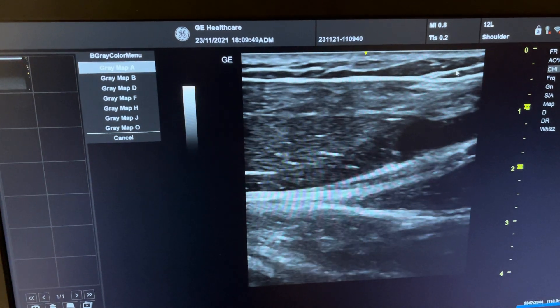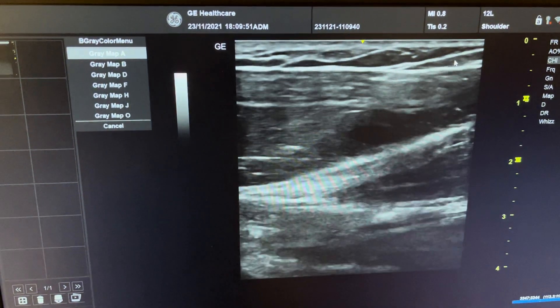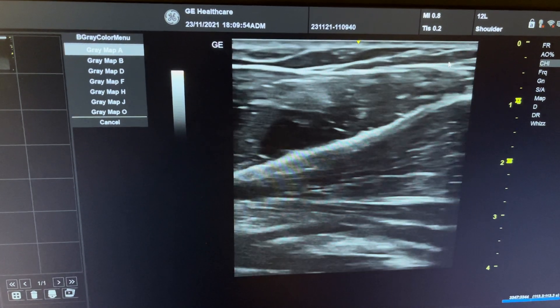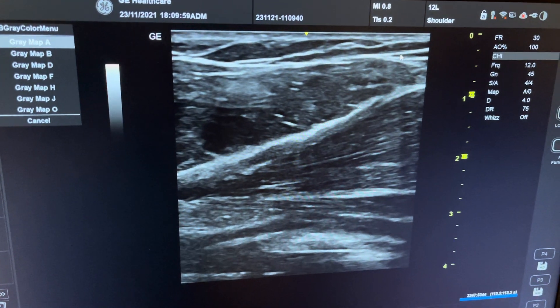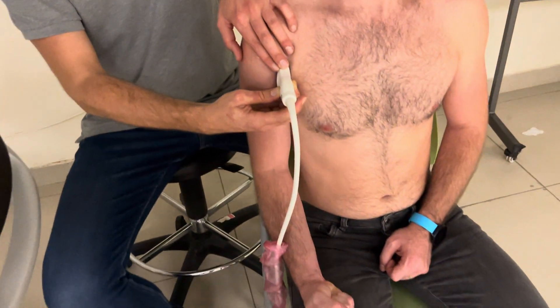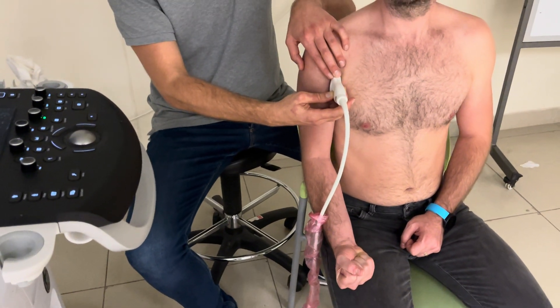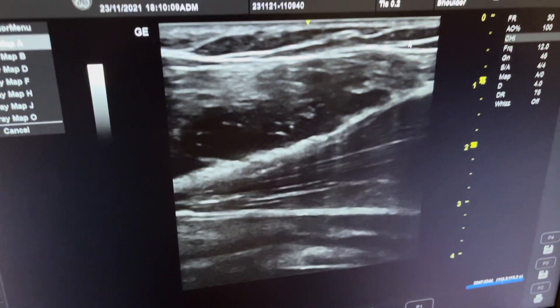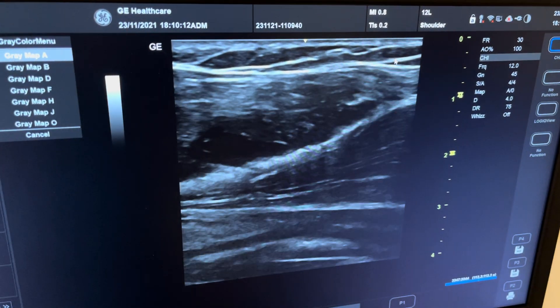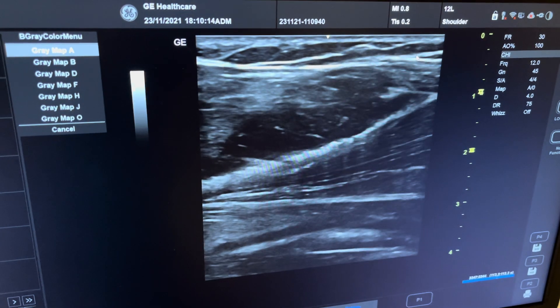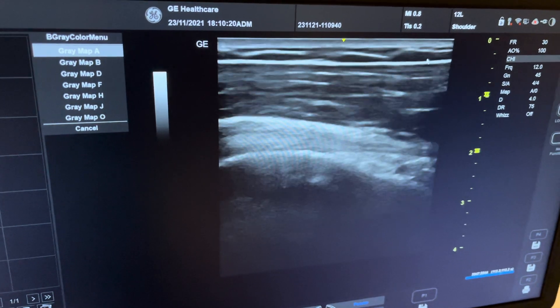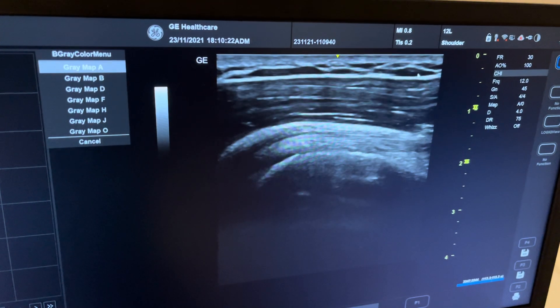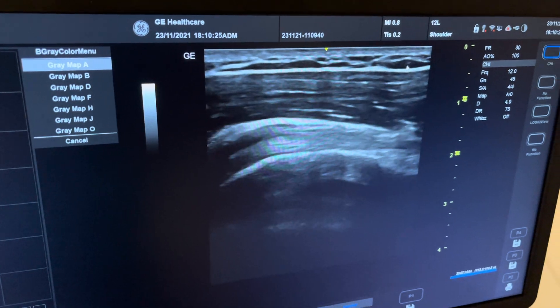Following the tendon further down, it becomes thinner and the muscle belly starts — this is the muscle belly of the long head of the biceps. If the patient makes a fist and performs supination and pronation, you can see the muscle belly of the biceps moving, confirming it is the long head of the biceps. Going back up, we return inside the groove. This concludes the video for the biceps.